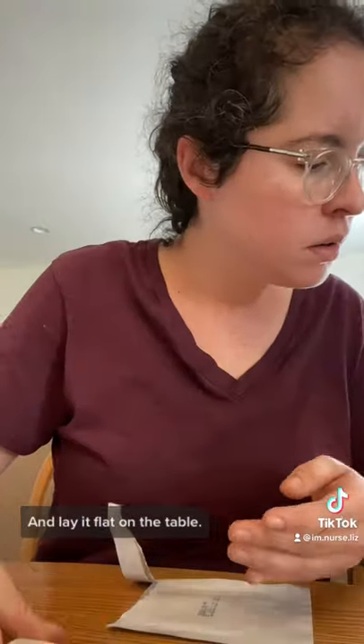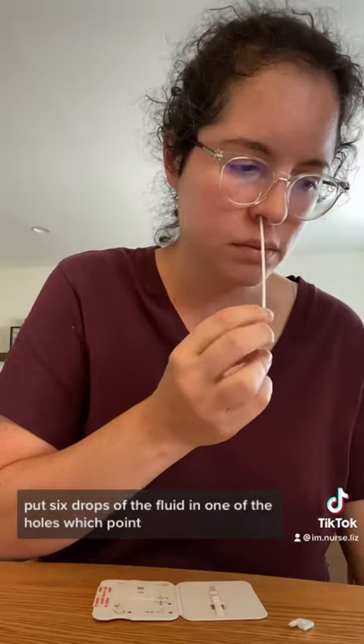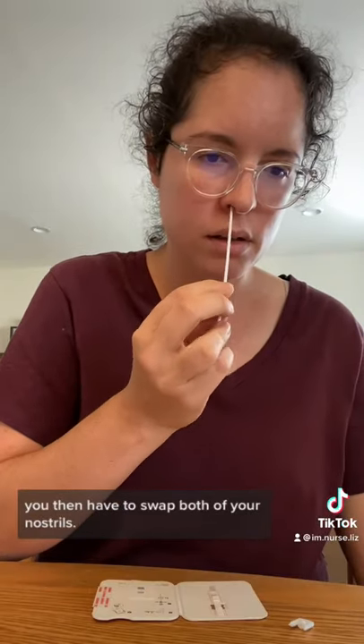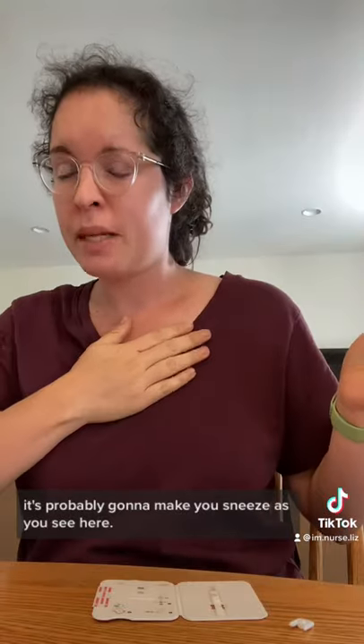It comes with really clear instructions. Open up the card, you lay it flat on the table, put six drops of the fluid in one of the holes, at which point you then have to swab both of your nostrils. You want to give a little bit of friction, not just go super light up there. It's probably going to make you sneeze, as you see here.